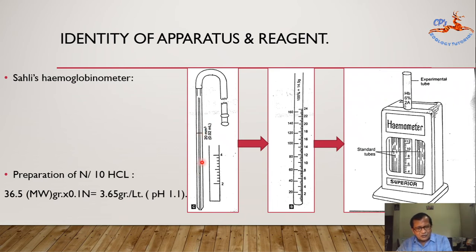This blood will be transferred into it carefully. When it is transferred, the tip of it will touch here, and by blowing inside, the blood will be pushed into the hydrochloric acid solution. Then it is carefully given out.